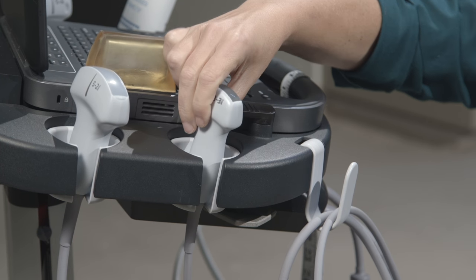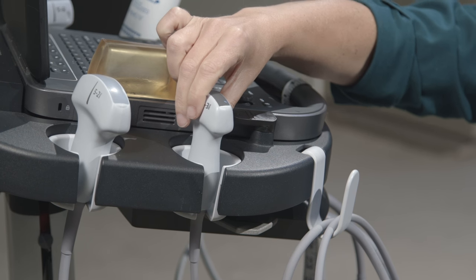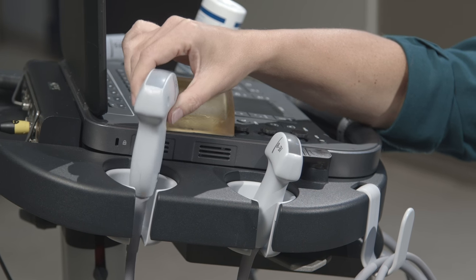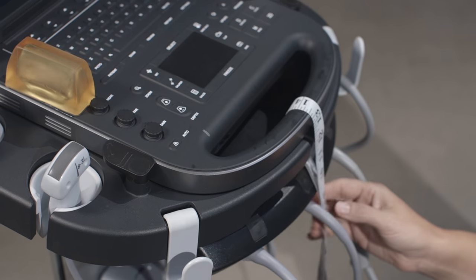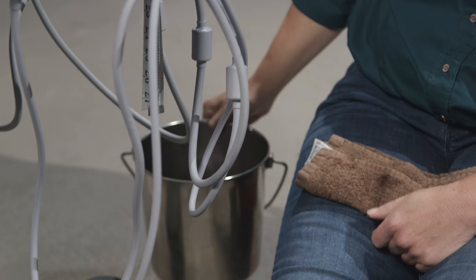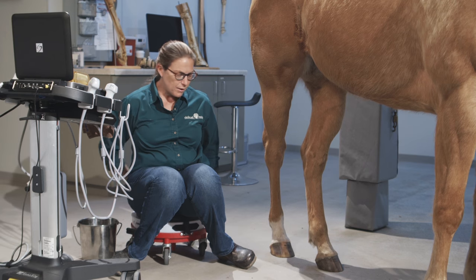In some horses — larger horses, a horse with really swollen legs, or if you can't clip — anything where you can't get good image quality, a convex probe would help you out. This is a mid-convex 8 megahertz probe, and there's also a 5 megahertz macro-convex probe. Other tools I use are a measuring tape to tell me where I am in the leg, a dry towel to keep excess gel off, and a bucket of water to keep the leg moist. You can also use alcohol, especially on a non-clipped leg — rubbing alcohol will often give you a better image than ultrasound gel.